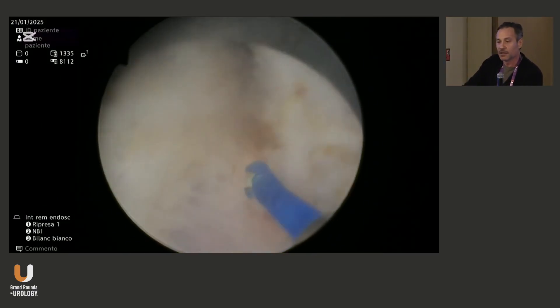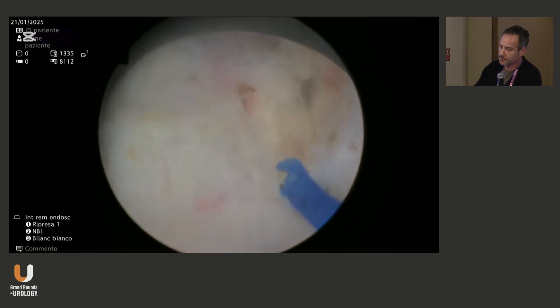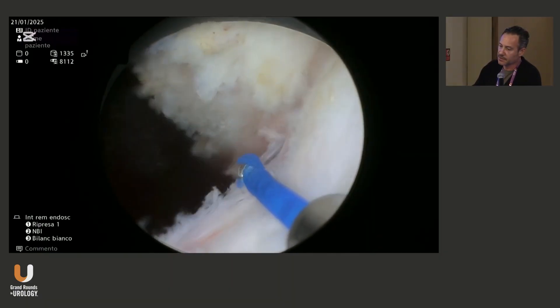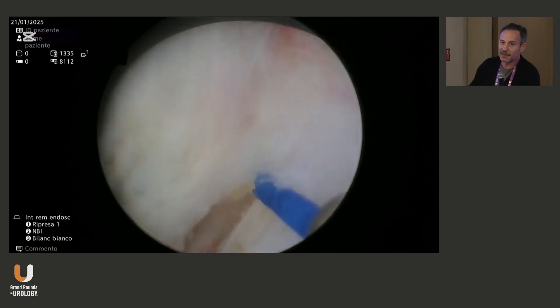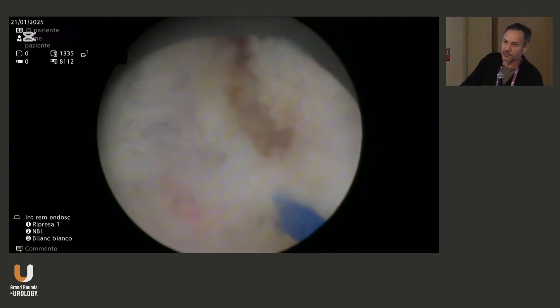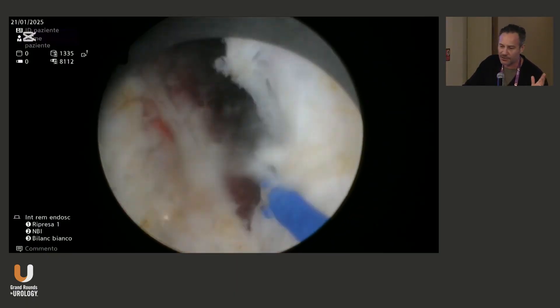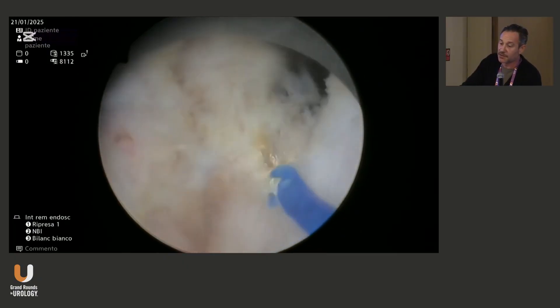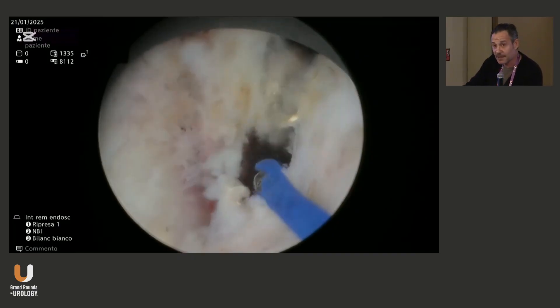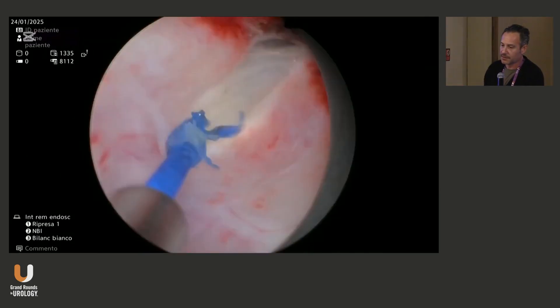Here we are on the bladder neck. Once you are able to find the plane, I don't think that ureteral orifices are crucial to see exactly where they are — because if you are following the right plane, you're not going to be in trouble with the orifices. But of course, if you are at the beginning of the procedure, you want to go back and forth and check, especially in large prostates, where the orifices are. So we're done with the left lobe and we proceed with the right one.